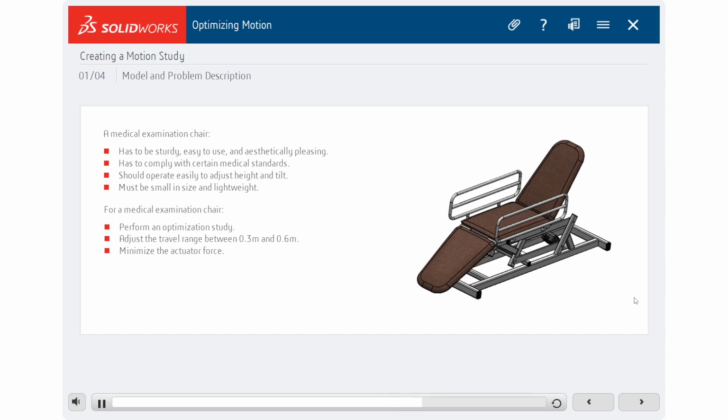The dimensions of the components that form the lifting mechanism are variable within a certain limit. In the optimization study, these dimensions are the design variables. The maximum and minimum height of the chair are the constraints monitored by motion data sensors, and the goal is to minimize the actuator force, also monitored by a sensor.